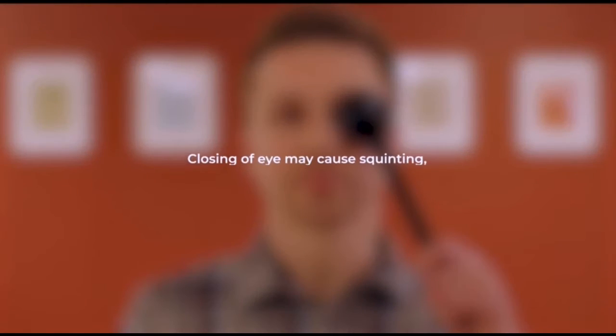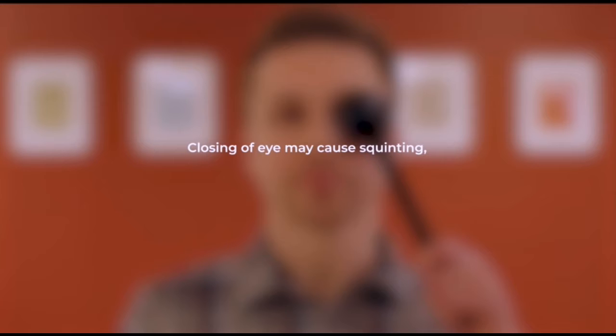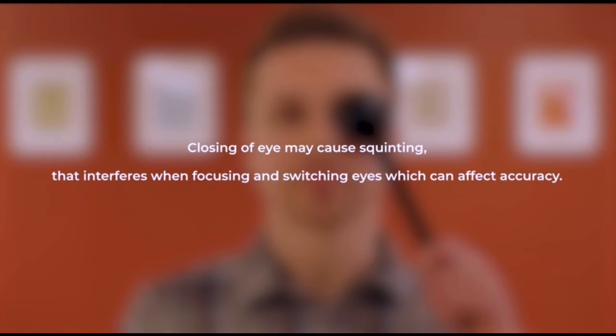All right, I'm gonna have you go ahead and stand up straight. Make sure you don't squint. Does this look like it's at eye level? Okay, good. Instruct the patient to lightly cover their left eye with the occluder, but still keep it open. Closing or putting pressure on the eye not undergoing testing may result in squinting of the eye that you're testing. That interferes with focusing when switching eyes, which can affect the accuracy of the results.